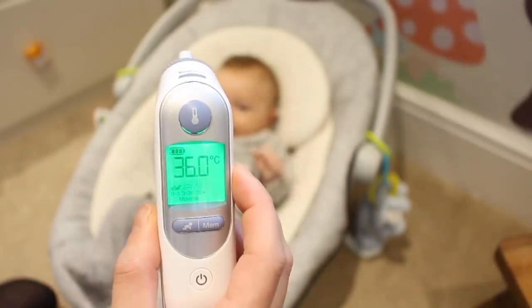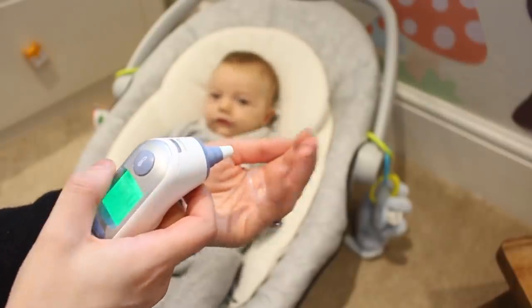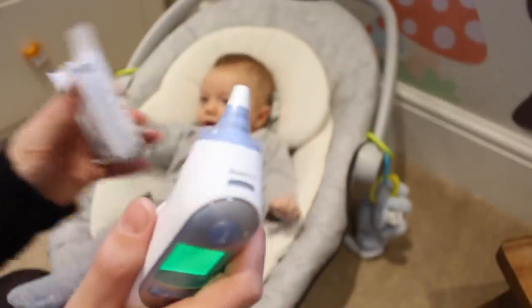Once you've taken the temperature, the colour-coded display will glow green for a normal temperature, yellow which means a fever, and red which means a high fever. You then dispose of the probe cover, which means the thermometer remains hygienic and there's no cross-contamination between users.